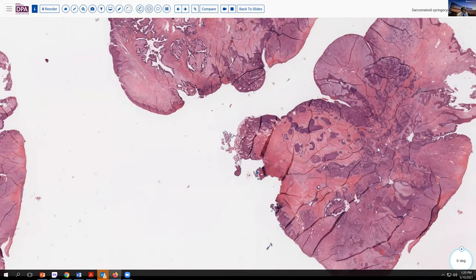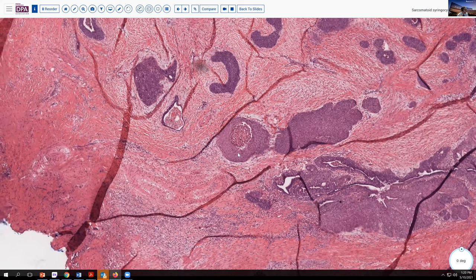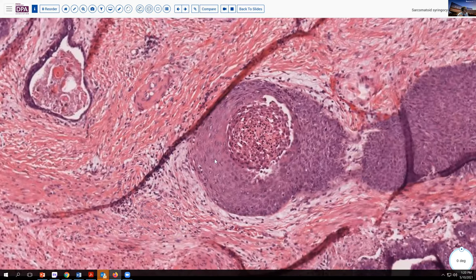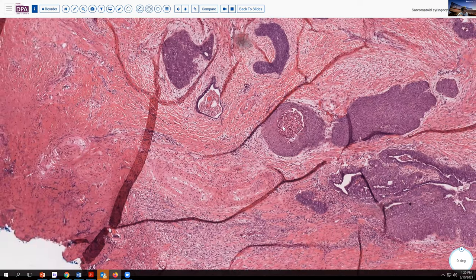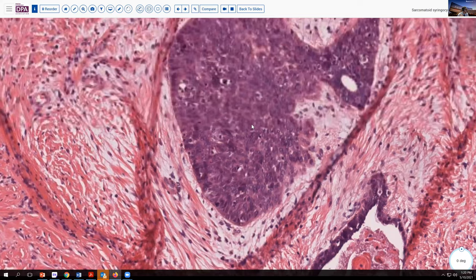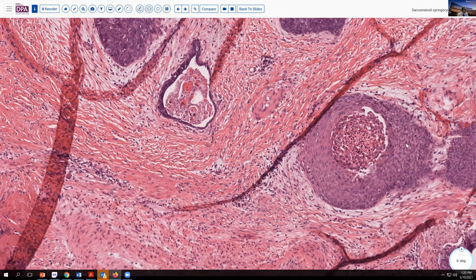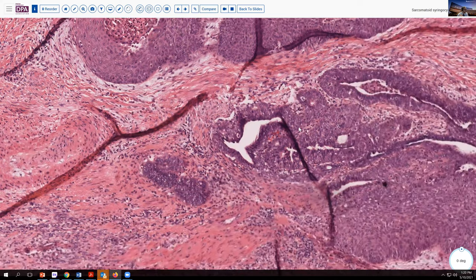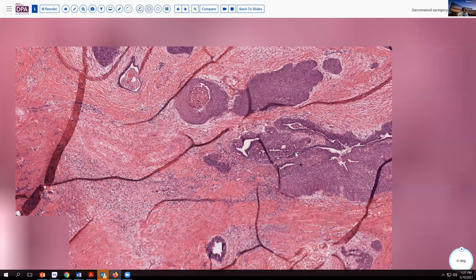Coming into a higher magnification, we'll focus first on this solid component here. We see that this has some areas with apparent epidermoid character, maybe even some little squamous pearls drifting off into the lumina here. Other solid areas show a sort of ductal type of structure developing, as you see here — little tubular glands. And then in addition, we have these sort of duct-like structures with somewhat columnar type lining cells, fairly malignant looking.